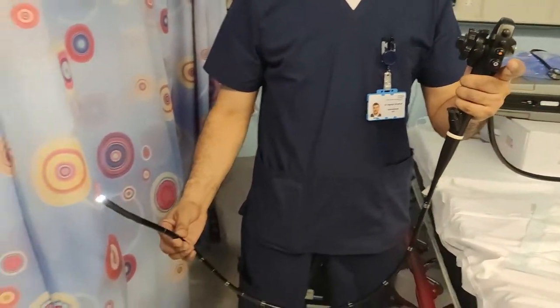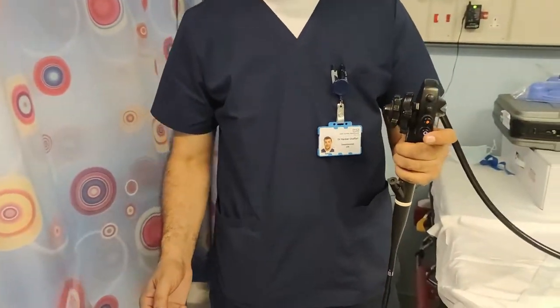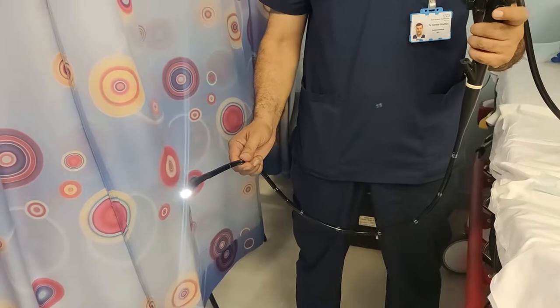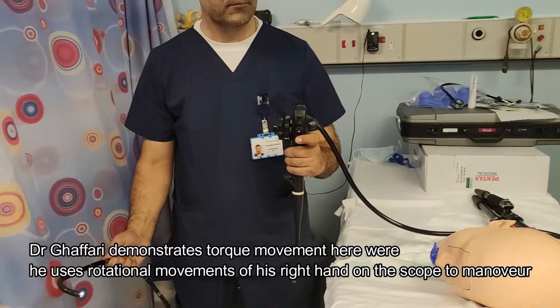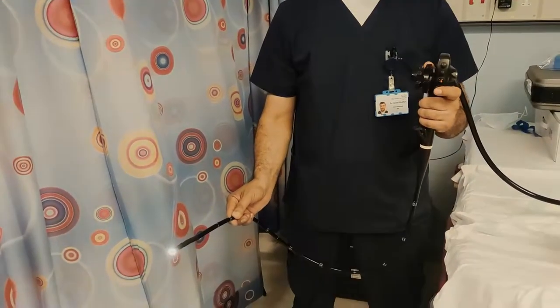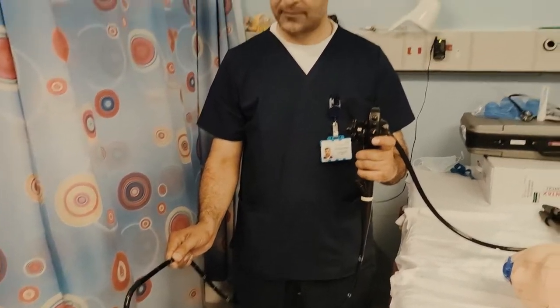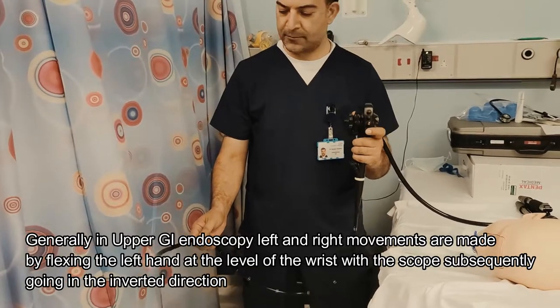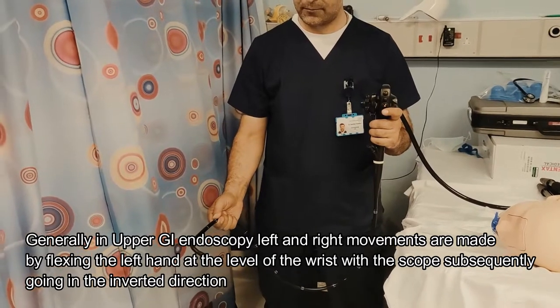One important thing with upper GI endoscopy is that we actually don't use the small wheel that much. Dr. Havari will show us how, using his left hand, he is able to maneuver the scope direction. Using his right hand for torque or his left hand, he can demonstrate: at the level of the wrist, Dr. Havari will make a movement which will make the scope go in the inverted direction.